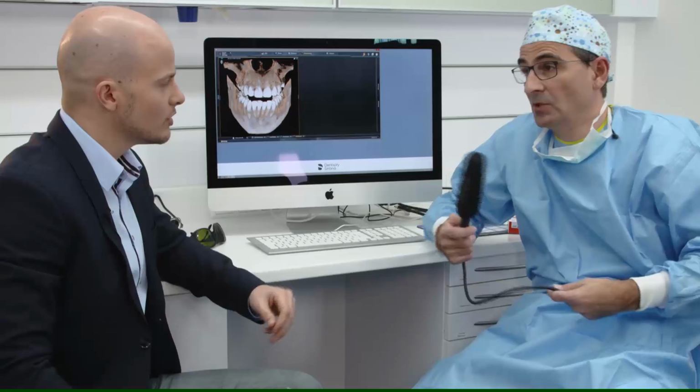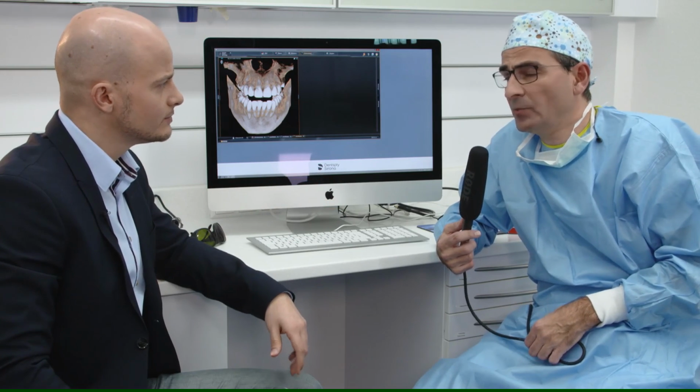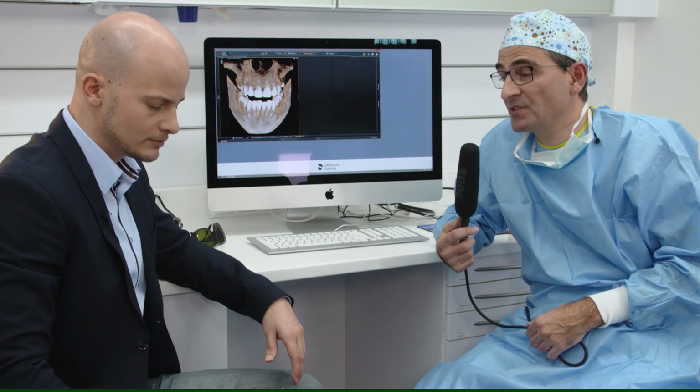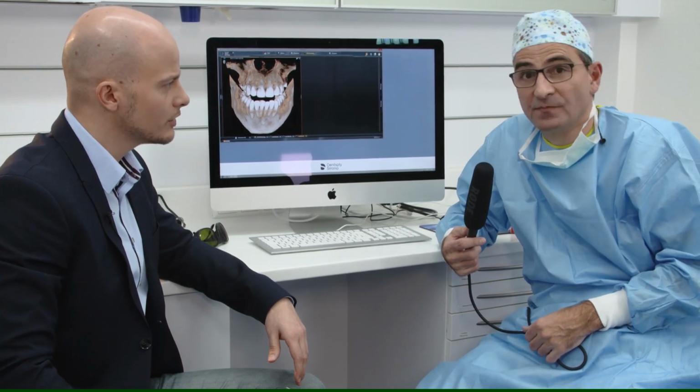Yes. And here we did not have enough primary stability. In the 3.8, sure, we had nearly 50 Newton centimeters. But on the 4.5, it only got up to 20 Newton centimeters, and this is not enough to go on directly in the surgery.